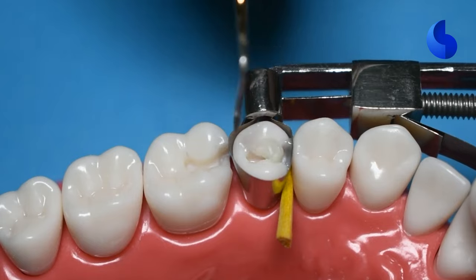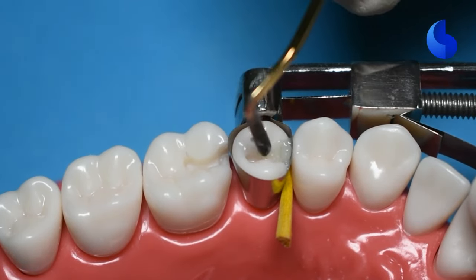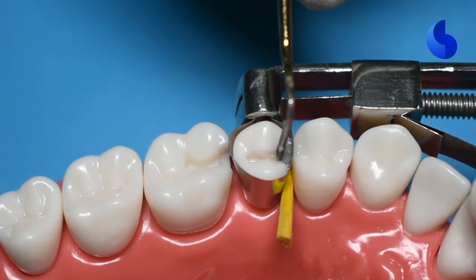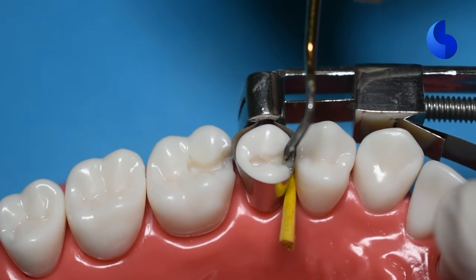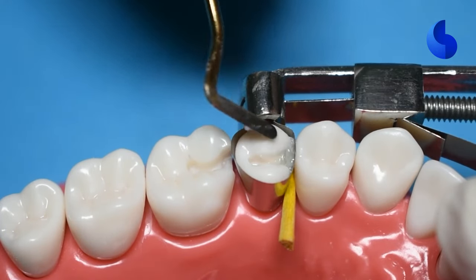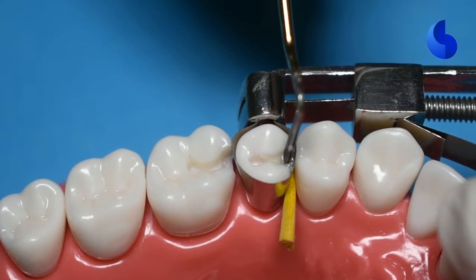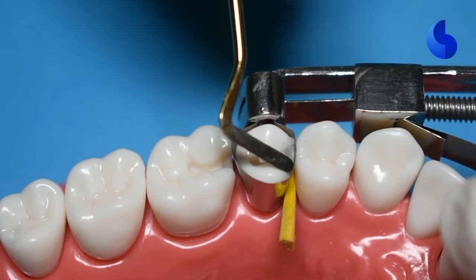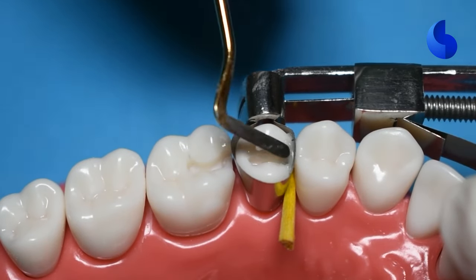Here I'm adding some more composite material to the proximal box area. What we're trying to do over here is to create that wall that we are missing, and we are building up our marginal ridge. So the marginal ridge should be at the same height as the marginal ridge of your adjacent tooth. You can do this by eyeballing, but also using maybe an explorer or a periodontal probe to see at what level the marginal ridge is on the adjacent tooth and try to build this up at the same level.